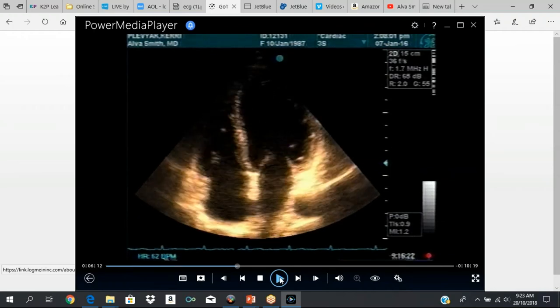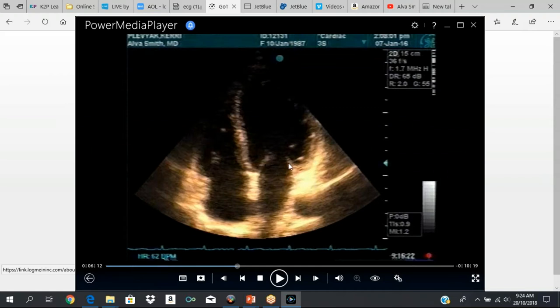To get to the apical four-chamber view, you move your transducer to the junction of the mid-clavicular line and the fifth intercostal space. The marker on the transducer is at about the 4 or 5 o'clock position, and the heart should be standing straight up. This is your left ventricular cavity, left atrium. Your mitral valve is right here — this is the anterior leaflet and the posterior leaflet of the mitral valve.